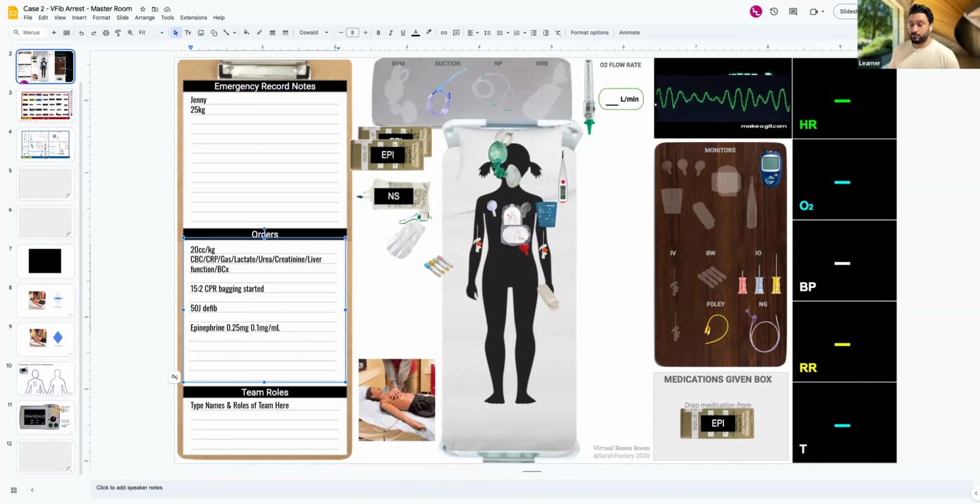Okay. And do I have someone available to be ready to secure the airway? Someone from the code team will be coming down shortly. Okay, there are no issues bagging the patient at this point. Okay, great. And as far as compressions, how is our quality of compressions at the moment? Continues as shown on the screen. Okay. And team, with the next rhythm and pulse check, if we can have compressors switch.